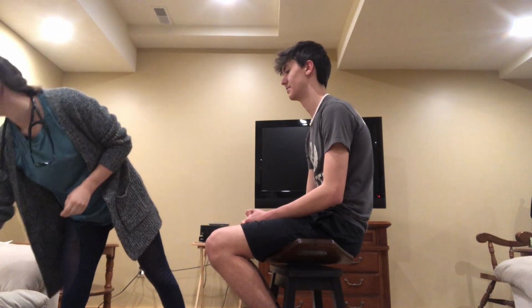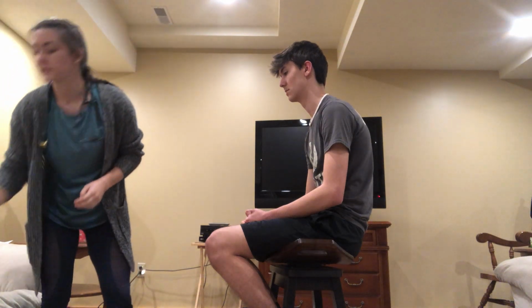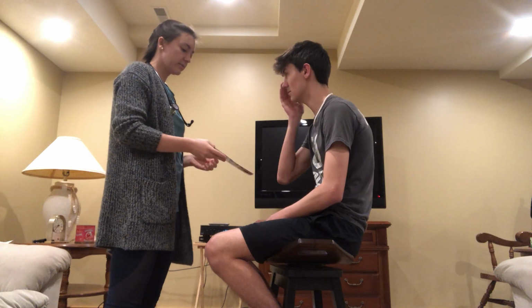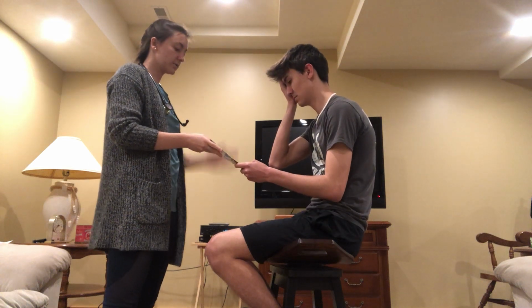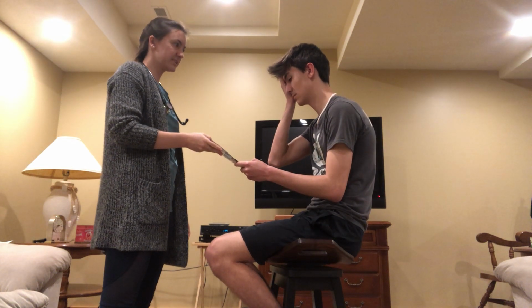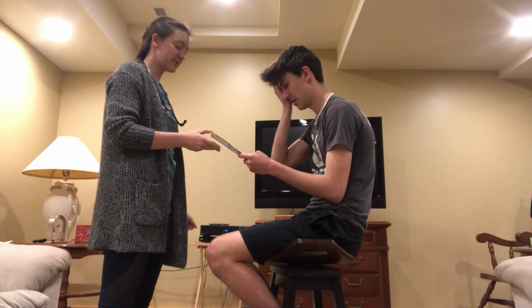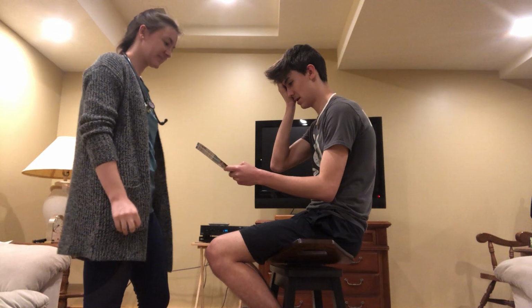I will then proceed with my eye exam. I'm going to check my patient's visual acuity using the Snellen chart. Go ahead and hold that about a foot away, and check your one eye. There you go. Check your first eye. Go ahead and read the lowest line that you can.